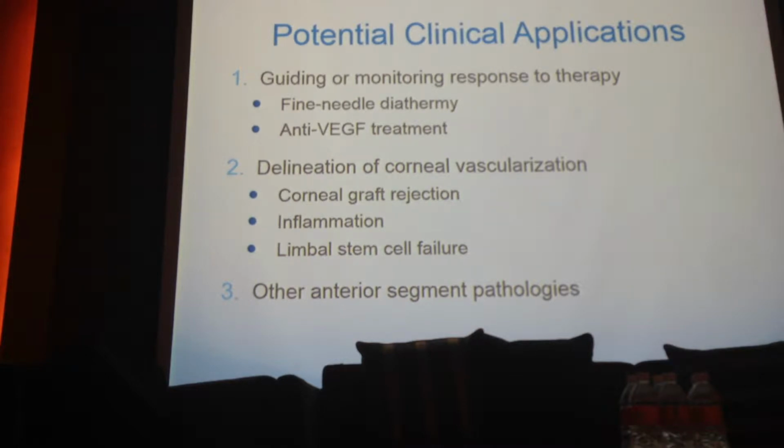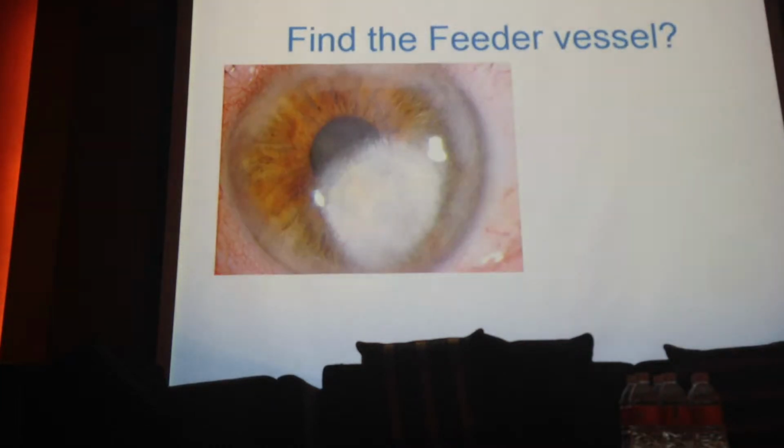and a whole lot of other anterior segment pathologies, not just in cornea, but also we're using it to look at pathologies in various forms of glaucoma. So I'll touch a little bit on that.